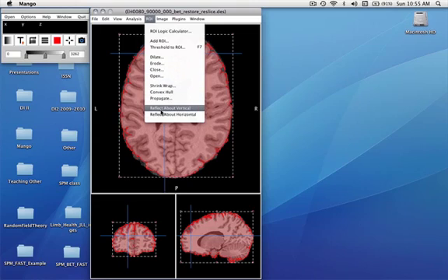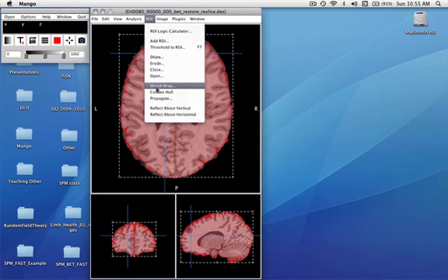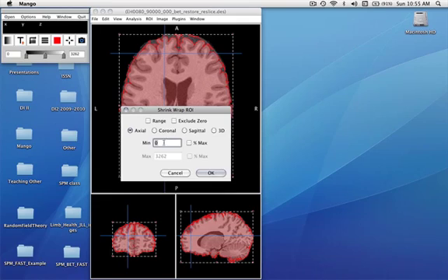We can reflect it about horizontal and vertical, which is good if you wanted to make a hemisphere measure and swap it back and forth. In this case, we're going to shrink wrap inside the shrink wrap. And we'll move up to 30% of max and see what that does.